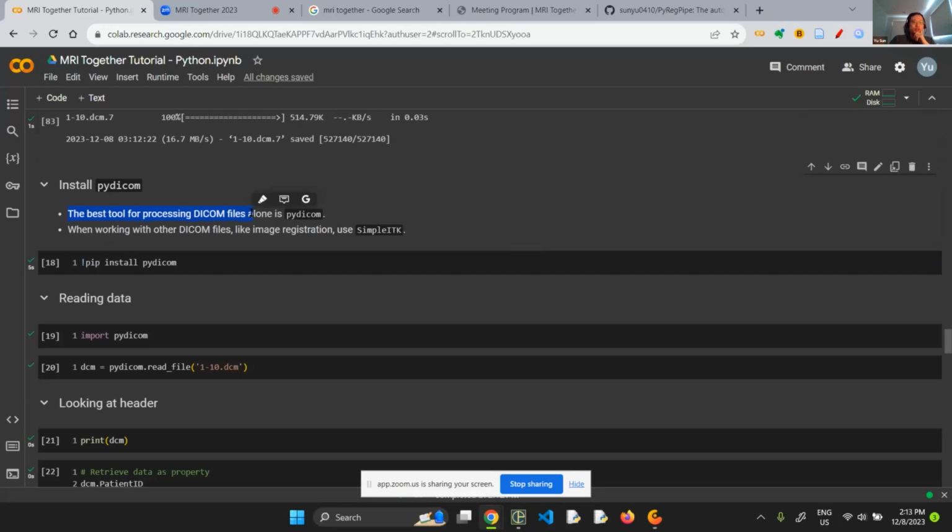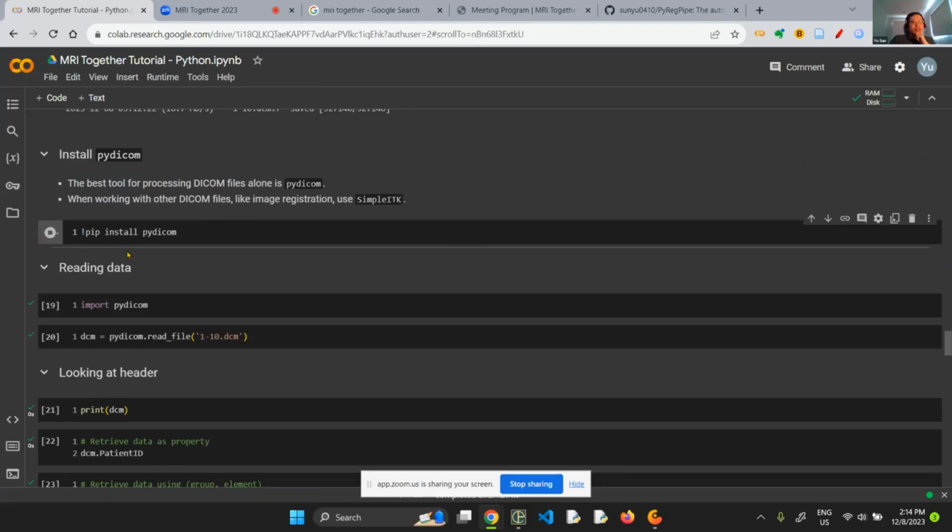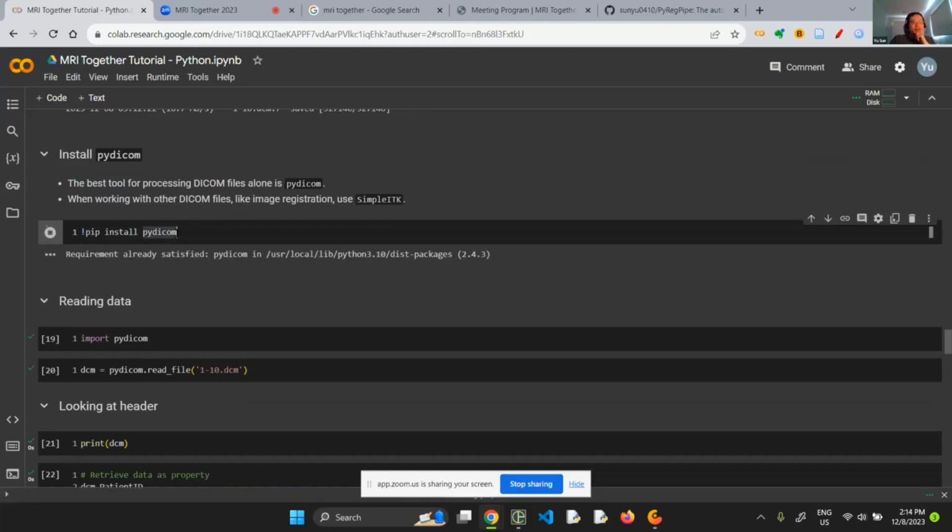If you want to work with DICOM images, like do image registration or run some filter, then SimpleITK is the tool for it. But all of these are quite related to the NumPy array. So knowing more about the NumPy array is definitely a great fortune for your future if you want to do a lot of data processing.